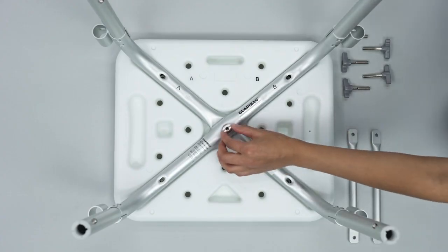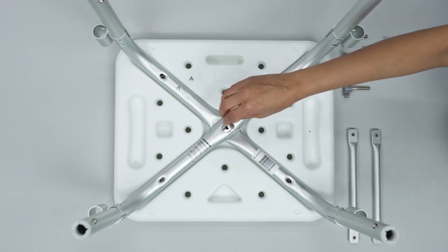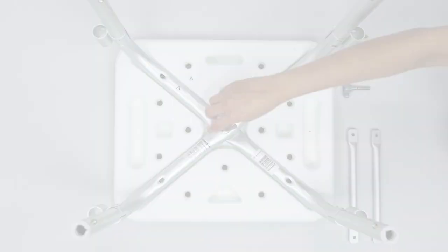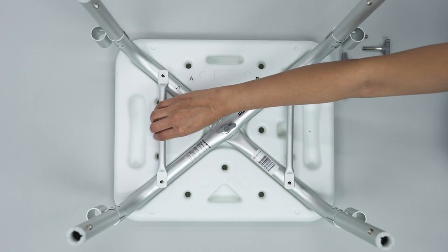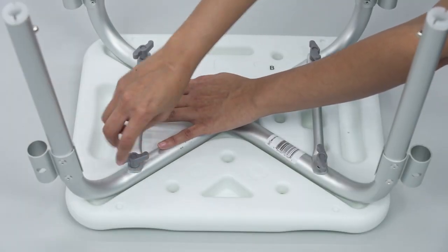Secure the center cross section using the curved washer and a hand screw. Place the reinforcement bars across mainframes. Insert a hand screw through each end of the reinforcement bar and mainframe.